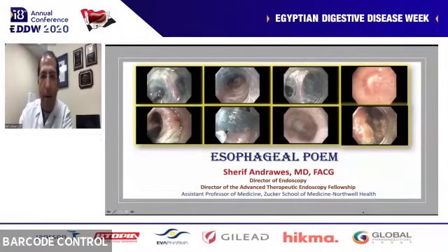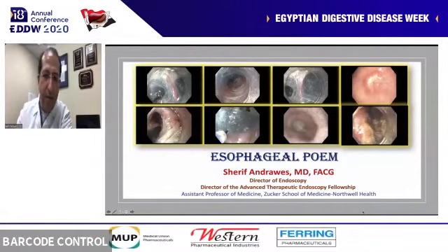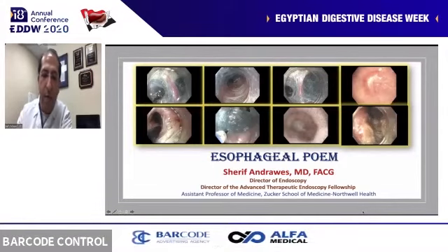So today I was given a task to talk to you about peroral endoscopic myotomy and third space endoscopy. And I wanted to make this talk a lot more practical, talking to you about a lot of the things that currently, in 2020, are adopted and accepted as the standard of care. I'm not going to focus much on studies.